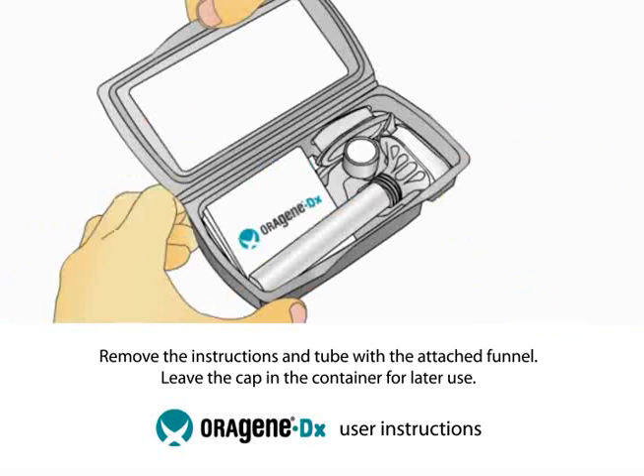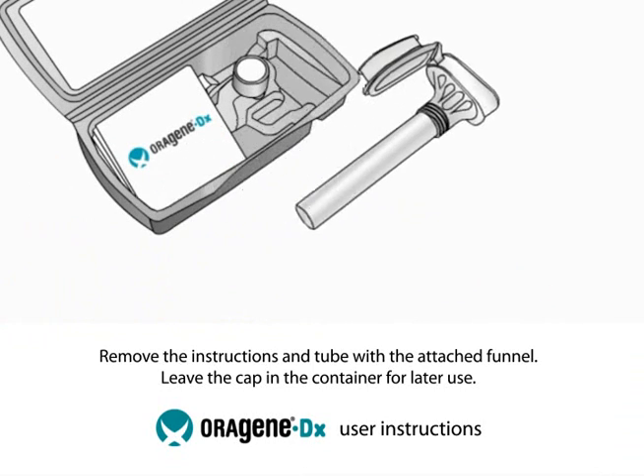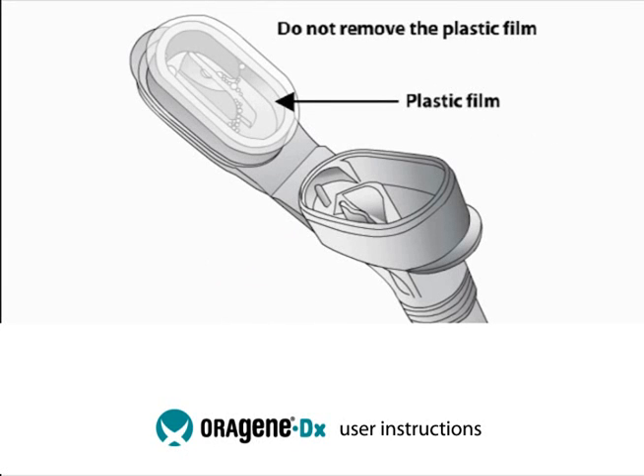To use the collection kit, open the packaging. Remove the instructions and tube with the attached funnel. Leave the cap and container for later use. The flip-top funnel lid contains a clear solution that will be mixed with the saliva sample when the kit is closed.